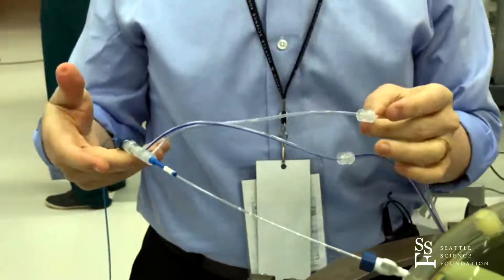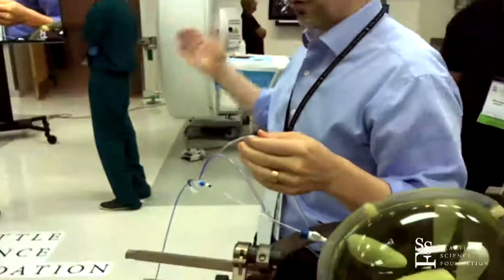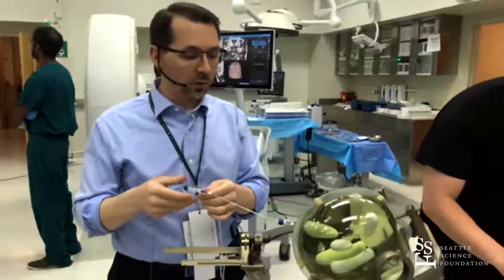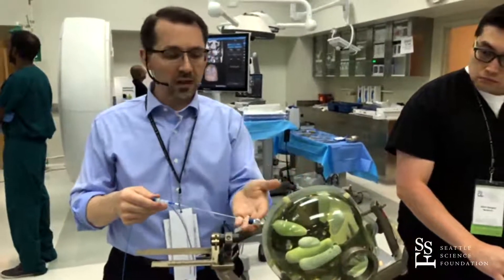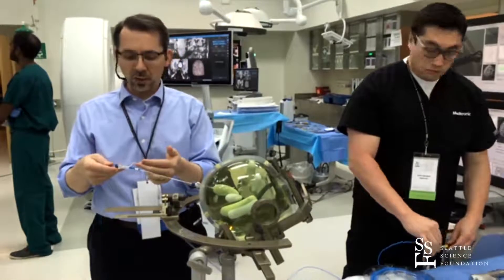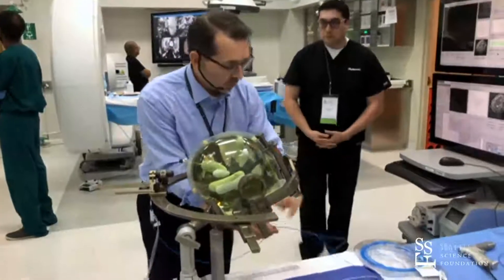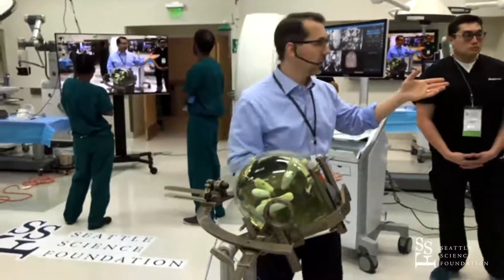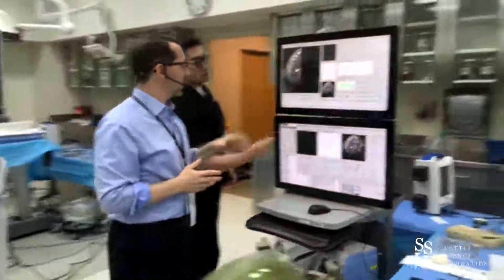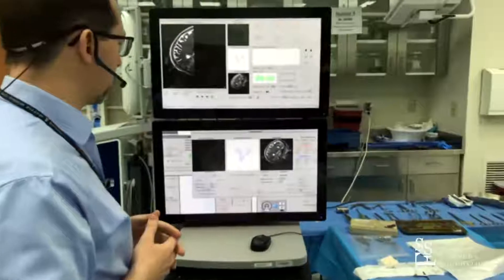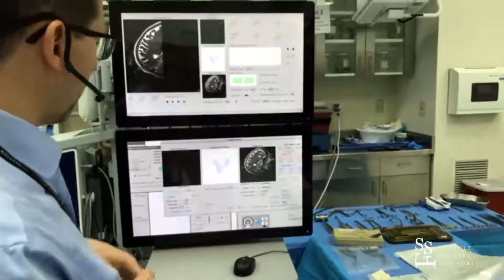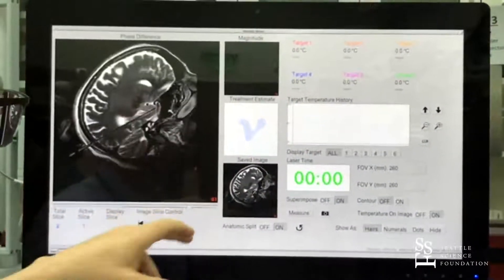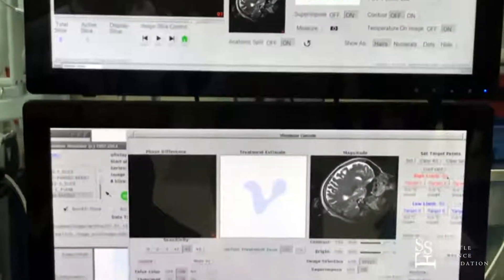At this point, if we were in the operating room, we could get an O-arm spin to make sure the fiber is where we want it. If satisfied, we disassemble the frame parts we want to and take the patient to the MRI scanner with the bolt and fiber in place, protecting this during transport. Assuming we get the patient into the MRI scanner and are satisfied with the location of the fiber in the lesion, we're ready to ablate — with images being piped directly to the Visual Ace workstation. This is a mock-up of what it looks like to have a fiber in the hippocampus.